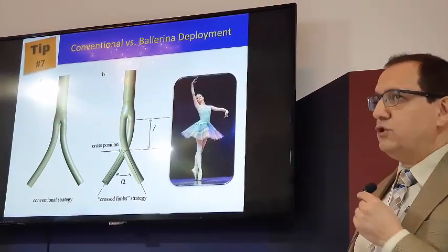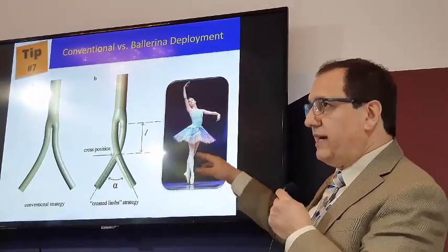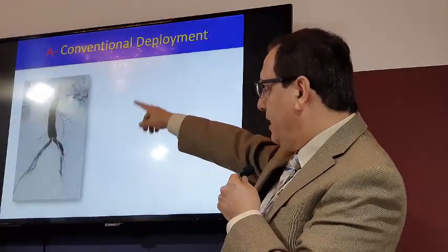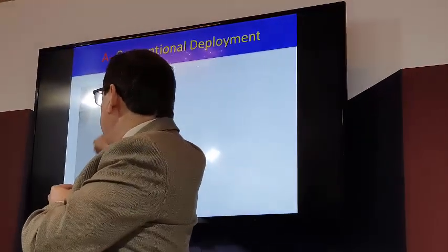Number 7, should you deploy it in the conventional or in the ballerina deployment? How do you decide that? Because you have both options. So I look at my wire. If you have both wires parallel to each other, like here, you see both wires going like that, straight up.